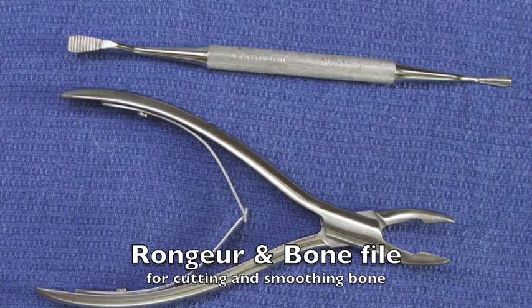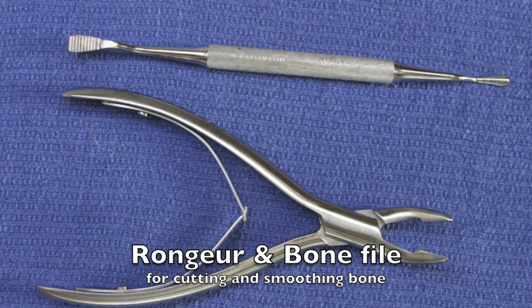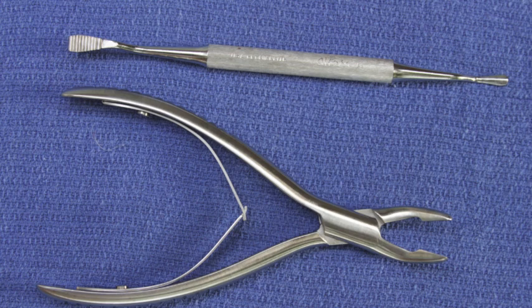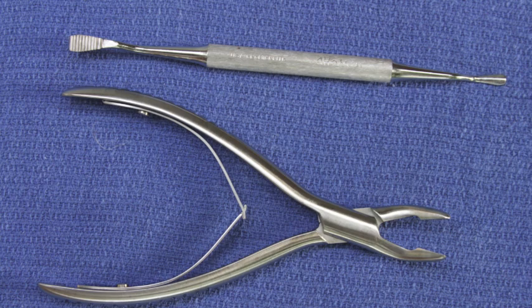What you see here is a rongeur and a bone file. The rongeur is used to cut bone, and it is not unlike a fingernail clipper in that it pinches the bone from the blade on both sides. It is used for cutting bone away, and then the bone file is used in conjunction with the rongeur, and it is a simple file that is used for smoothing rough edges of bone. Both of these instruments are used routinely in oral surgery.